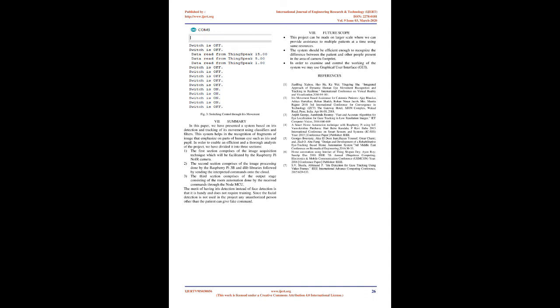To reduce the processing time, we can keep track of only one eye because both eyes' movements are synchronized. We must ensure that we take a rectangle shape for the image, so we have to take all the extreme points of the eye. Once the detection is complete, we assign different code words to both left and right positions of the eye in different fields. Those code words are uploaded in the channel created on the ThingSpeak platform. We can assign values on the field using API request write channel feed.